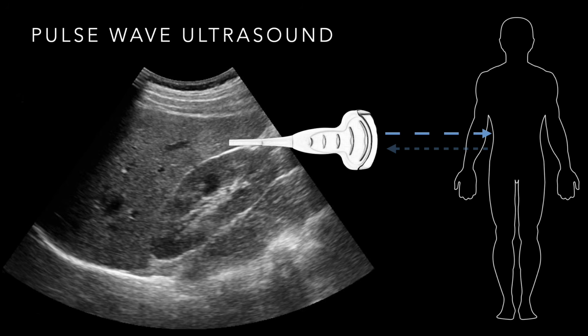A good conversation is a parlay back and forth where someone says something and then listens, and the other person says something and they listen. And so ultrasound in the best form is what we call pulse wave ultrasound, where it's a pulse of sound, and then it's going to pause and it's going to listen for that sound to return and then do something about that, right? And it's just a series of different pulses. If it's just constantly blasting, you kind of lose all that signal, right? So it's pulses of sound, and it listens for that return of that sound wave and then displays it, right?